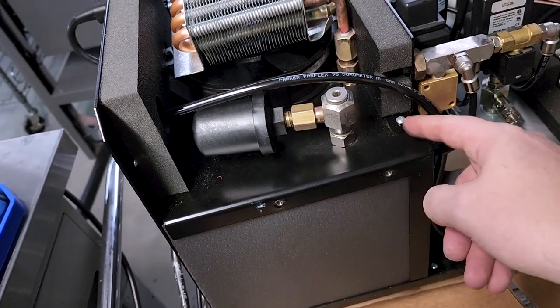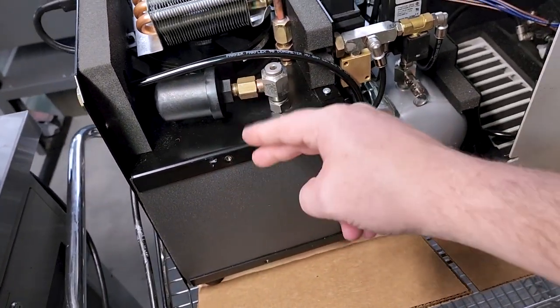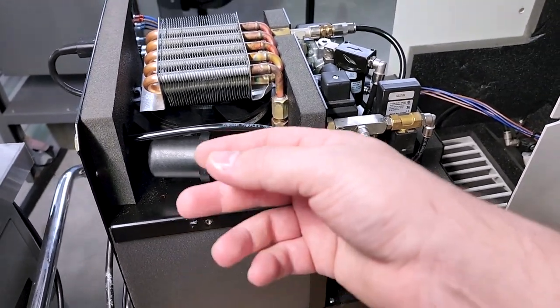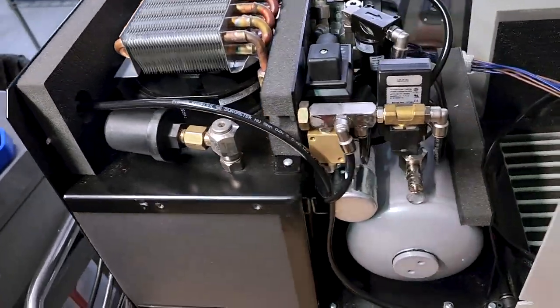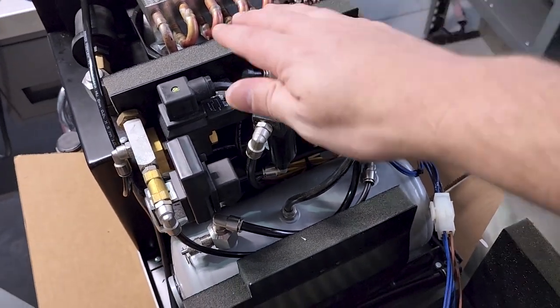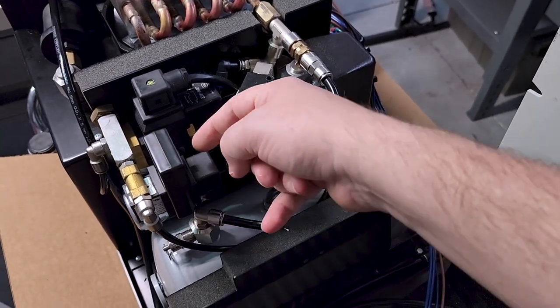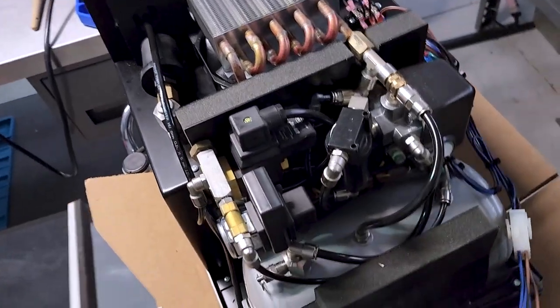So this is your incoming air, and that is a muffler. That is because your compressor oscillates the air, and just the oscillation of the air itself generates excessive noise. So they added a muffler to the air input. It's a pretty neat and simple device. It works on its own. So when they get energy, they go into their function until they're done with that function based on the timer. And then it goes into total compression, which we'll hear in just a moment.